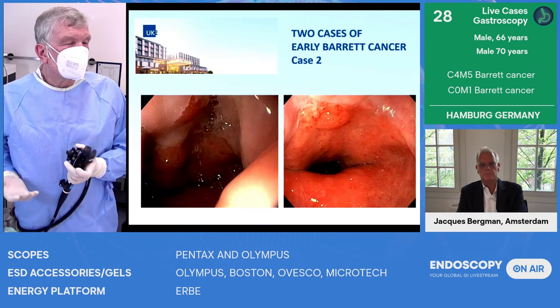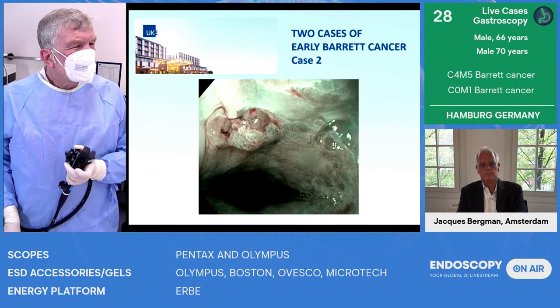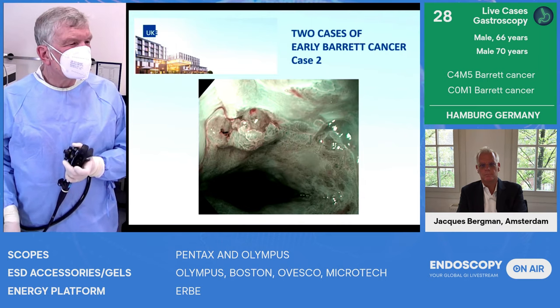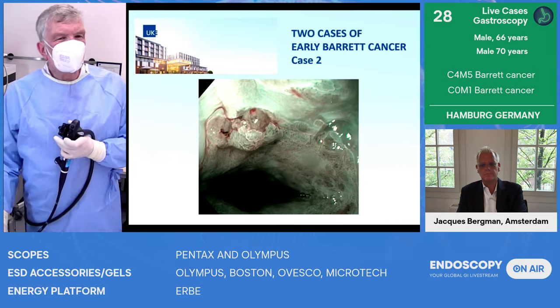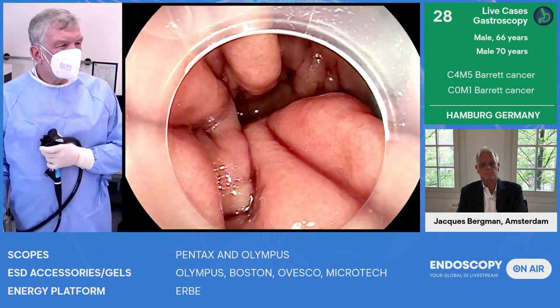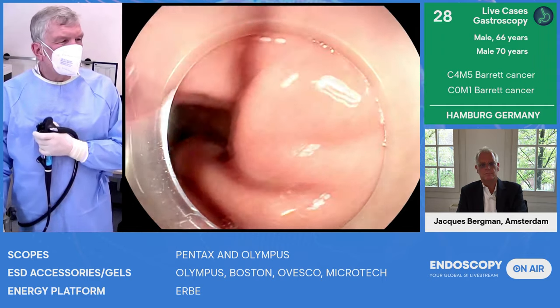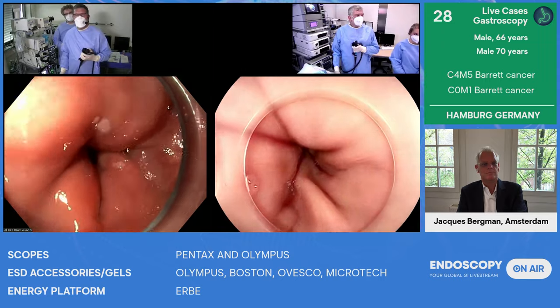And then if you know the histology as a referral center, next one, of course, you can image it in a way that you see it's clearly abnormal, also astructural. So let's go back to endoscopy. We are at different stages, Helmut and myself, so maybe we can add Helmut to the picture. And I have already started here.